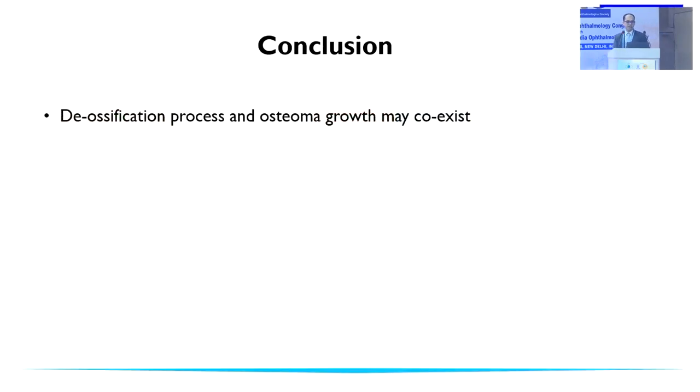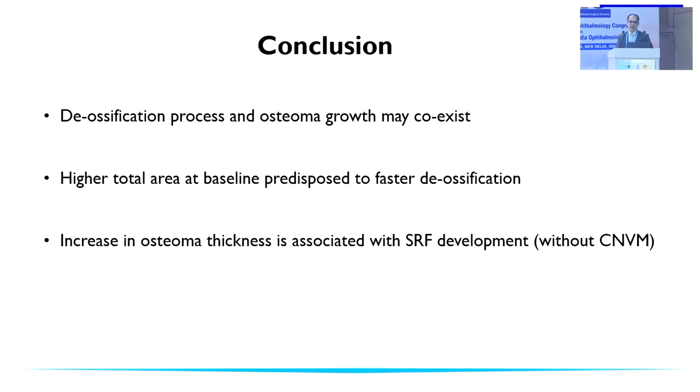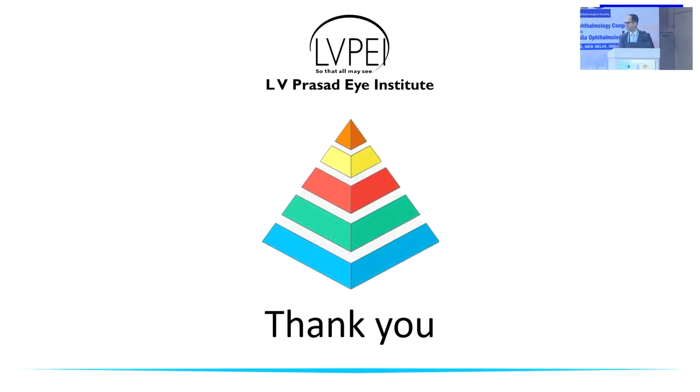Just to conclude, deossification process and osteoma growth can coexist. The higher total area at baseline can predispose to faster deossification, and an increase in osteoma thickness and size is associated with SRF development without CNVM. Thank you.